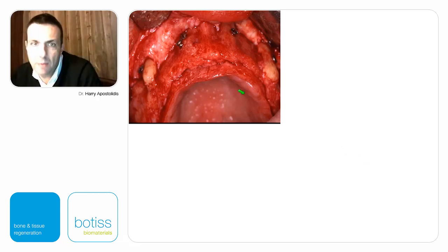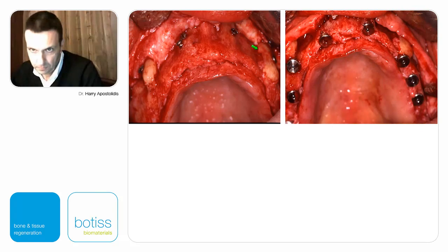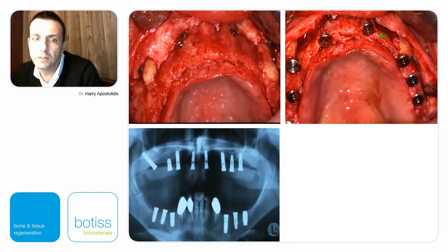So what happens? You see resorption after 6 months. We have almost 40 to 50% resorption here, only in these 2 blocks, not in the ones posteriorly. Well, we placed our implants back in 1999. We saw that here the bone is thin, but back in 1999 we didn't do much about that.